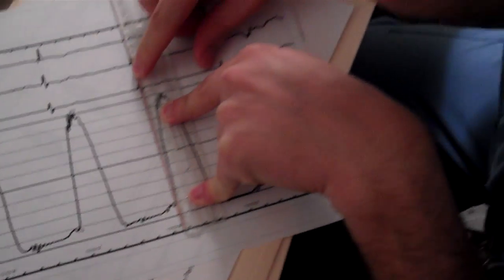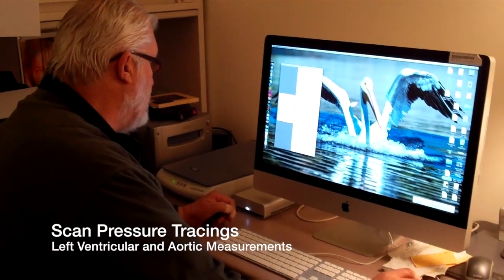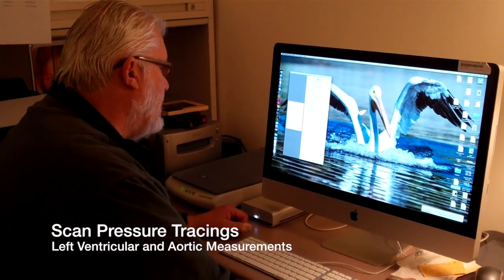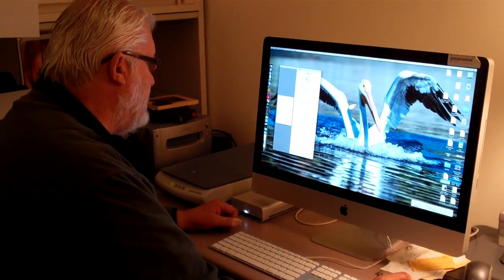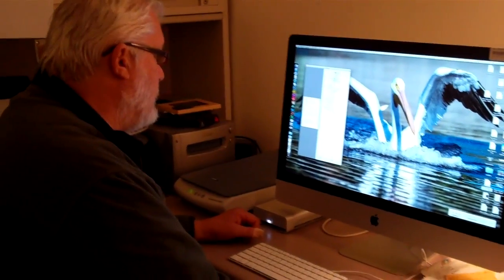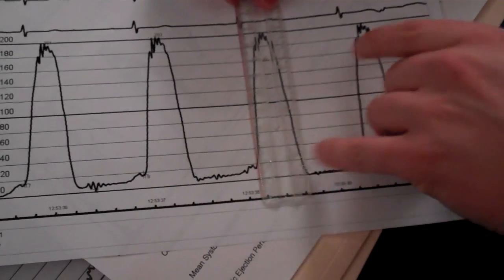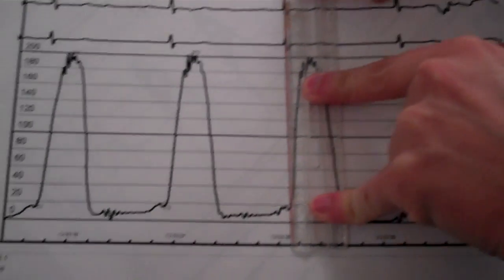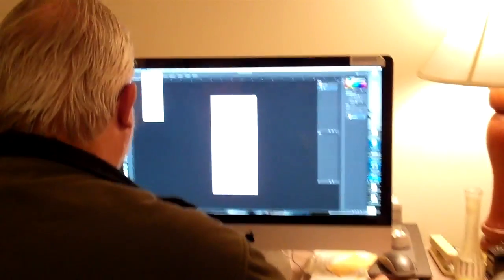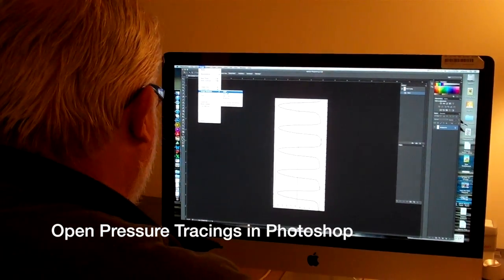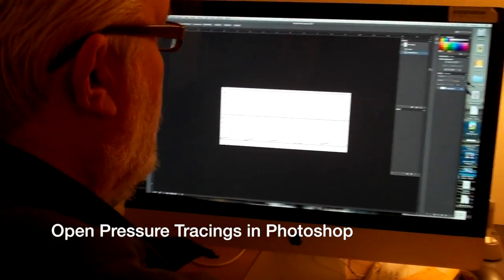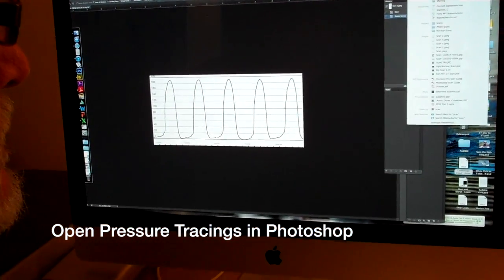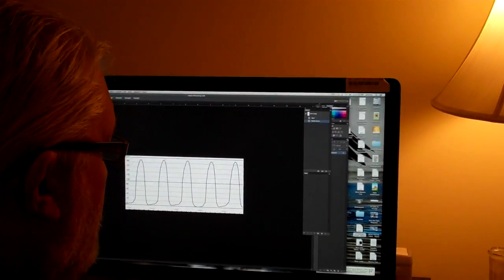So the first step is to scan the left ventricular and aortic pressures in. I scan these things at at least 300 dpi and use the black and white or grayscale settings. You don't obviously need color and I scan them as jpeg files. Either the LV or the aortic pressure tracing first, and then in Photoshop rotate the thing clockwise to get it horizontal and then open the second scan.